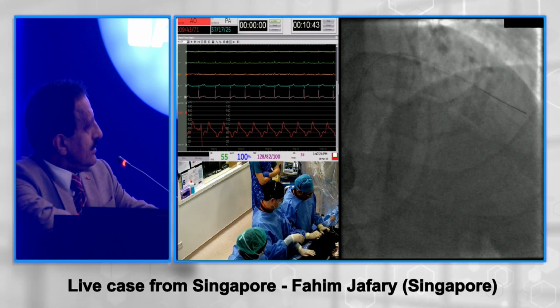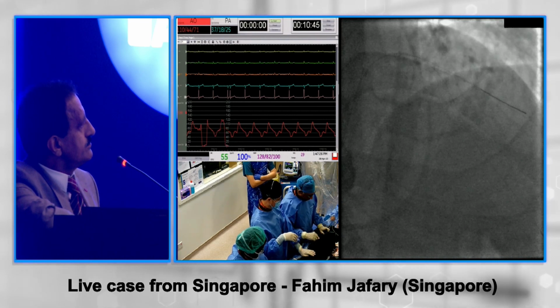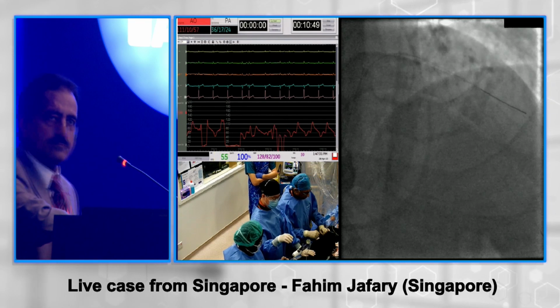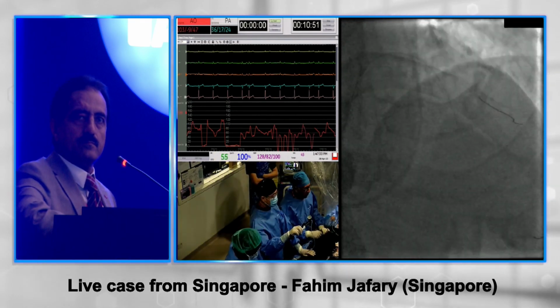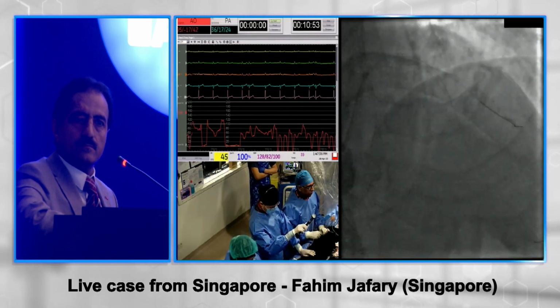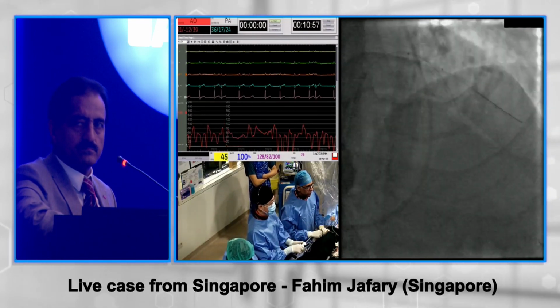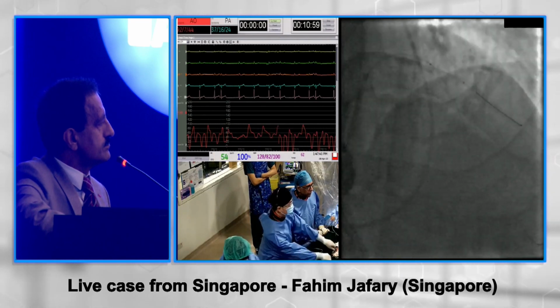The other issue, for me personally, is that when you have a heavily calcified vessel, even when the side branch doesn't apparently look calcific, there often is a nodule or something there that precludes you from getting decent expansion. And an underexpanded stent is a far worse proposition.